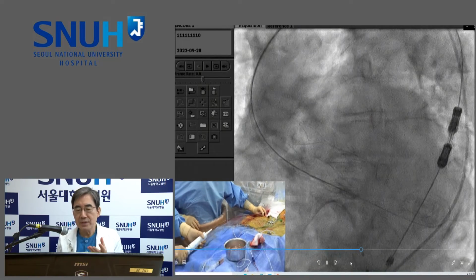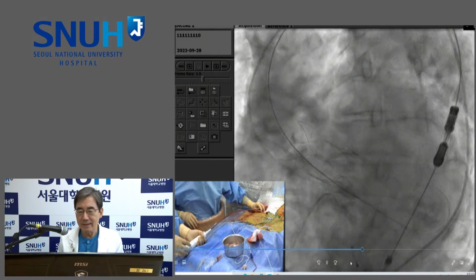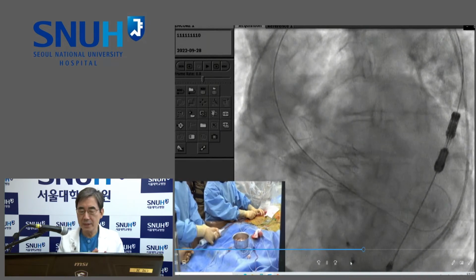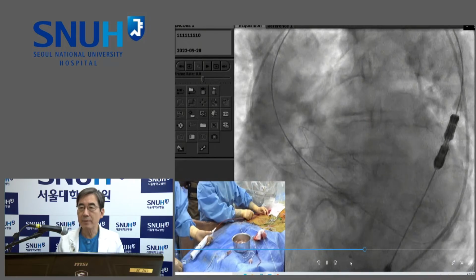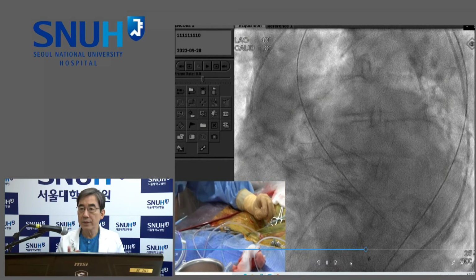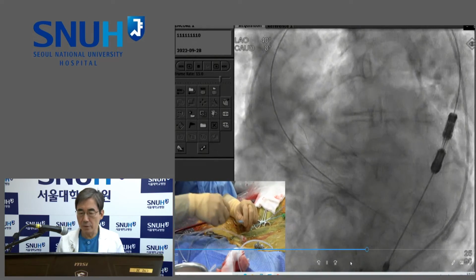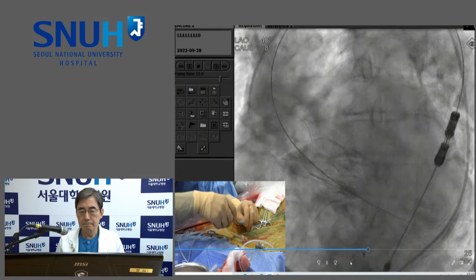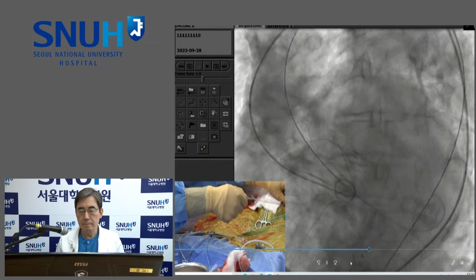If you decide to select the Evolut Pro for bicuspid AS, why not Accurate? Because when we compared in registry data Neo 2 and Evolut Pro, the paravalvular leakage is less and complete AV block is less with Accurate Neo. Thus, if you decide on Evolut for bicuspid, you can do Evolut. You can do Accurate. We need more experience about that. But of course I'm worrying about the importance of predilatation. Predilatation is very important for Accurate Neo. That's what I understand. In bicuspid valve it is not possible in every case, but you may not get much out of it.